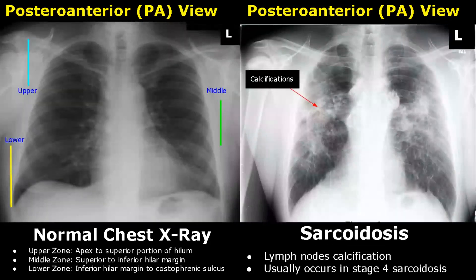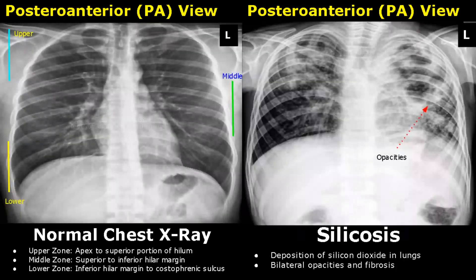Lymph node calcification may also occur in some cases of sarcoidosis, usually in stage 4. Silicosis occurs when there is deposition of silicon dioxide particles within the lungs — mine workers and tunnelers usually suffer from silicosis. On x-ray, we will see bilateral opacities and areas of fibrosis.